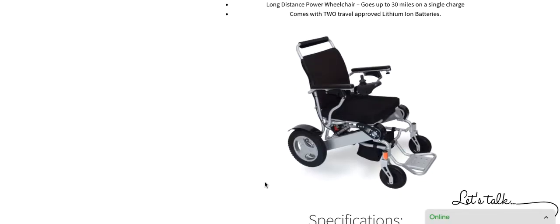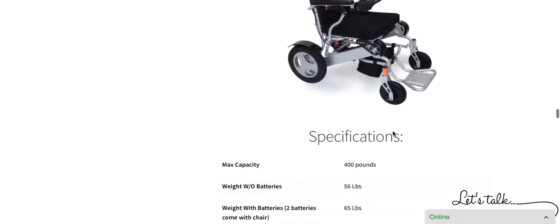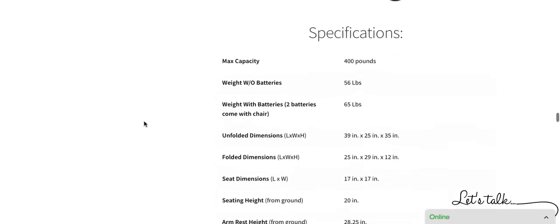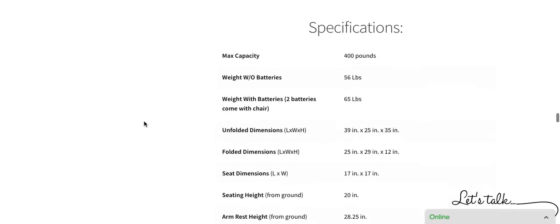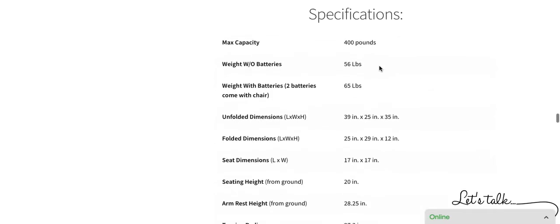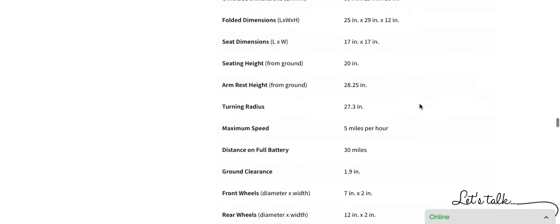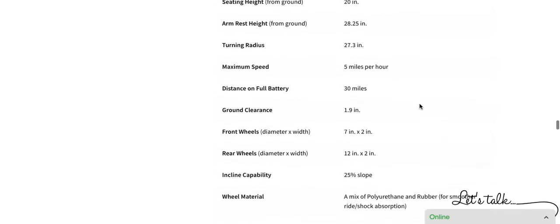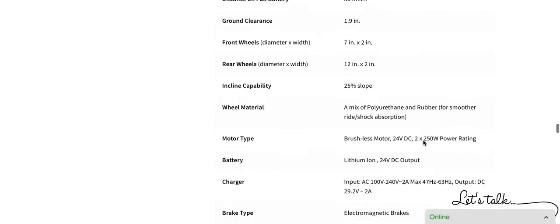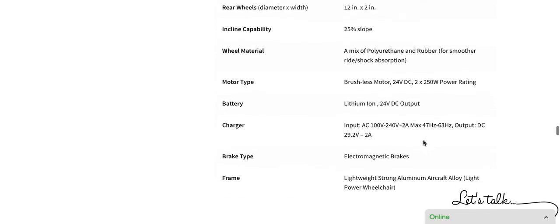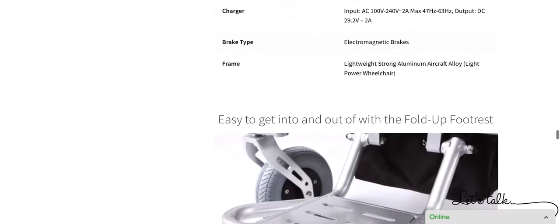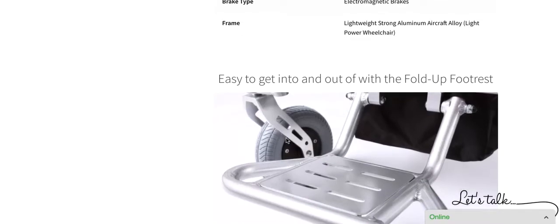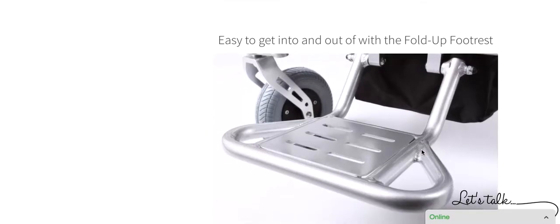And it comes with two travel approved lithium ion batteries. You can see the AHXLS. The footrest very easily folds up and gets out of the way. And it, of course, comes with a basket underneath. You can see by going to quickandmobile.com. You can scroll down on the first page of the website and find the wheelchair category. You can click on our AHXLS and scroll down just like I'm doing and you can see literally all of the specifications. 25% slope inclinability, electromagnetic brakes, very easy to deal with and, of course, it is a very easy to get in and out of chair with its fold-up footrest.